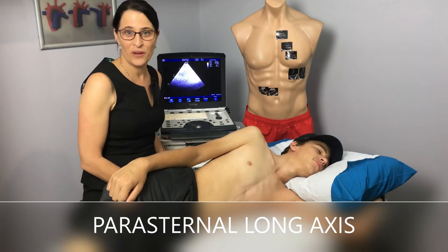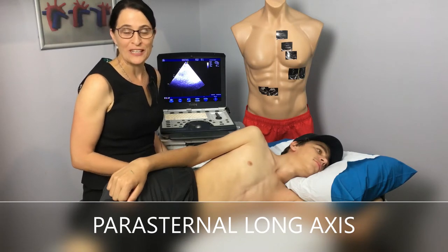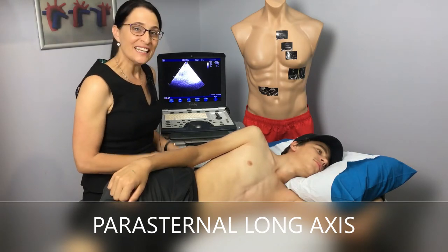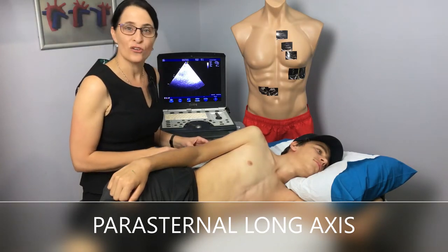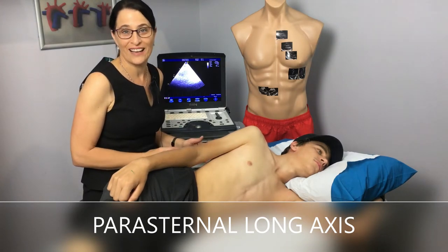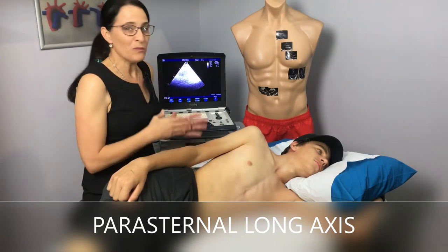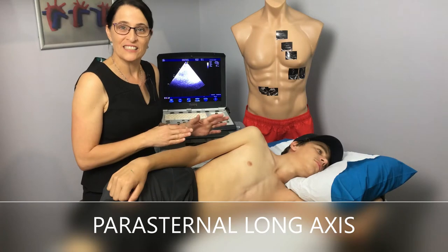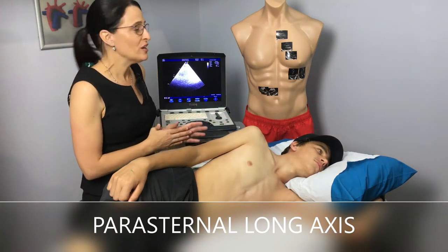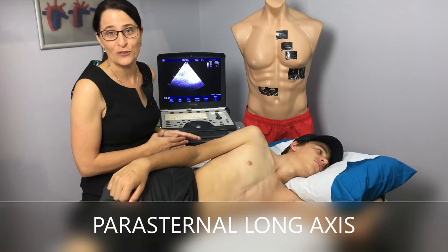Welcome to the ECHOED ECHO Skills tutorial. My name is Ruth Ram. In this tutorial I would like to focus on the parasternal long axis images. Before we start, it's important that you know that there are in fact three parasternal windows.